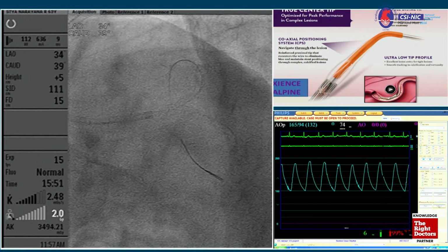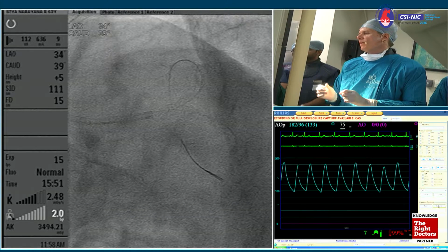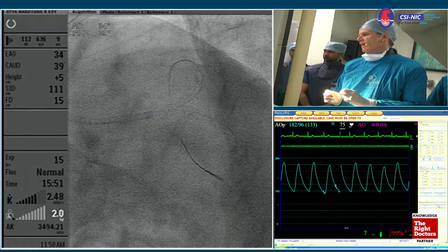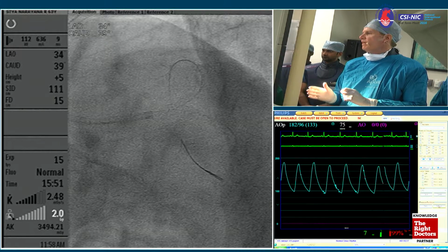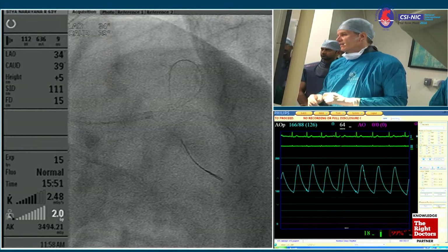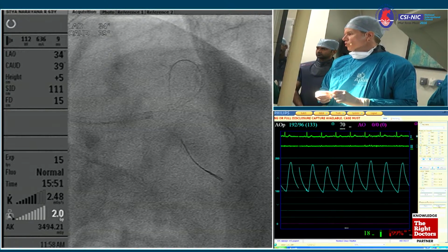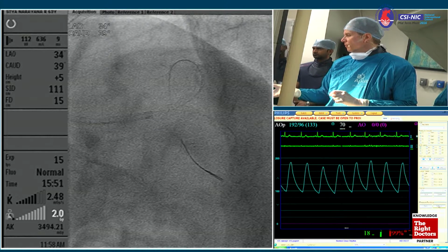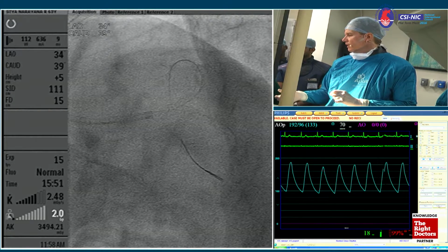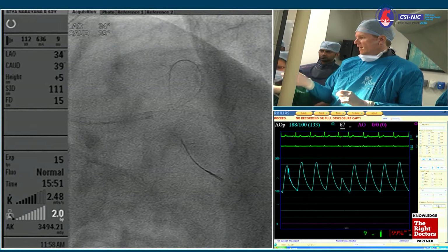I agree with you, Hui Chim. Most likely we will end up like this, but because we discussed it, I would like to take a look and see now, and then we don't need to discuss. I believe I will also end up putting a short 3.5 stent in the LAD, which would then end up as being a TAP, which is a good procedure. Finally, 2 stents, which is then okay. But we made the attempt of having 1 stent. If this is not possible, we go with 2, which is absolutely no problem. You can go with 2 without any doubt. Let's have a look how it looks in the IVUS. So we have the IVUS probe here.